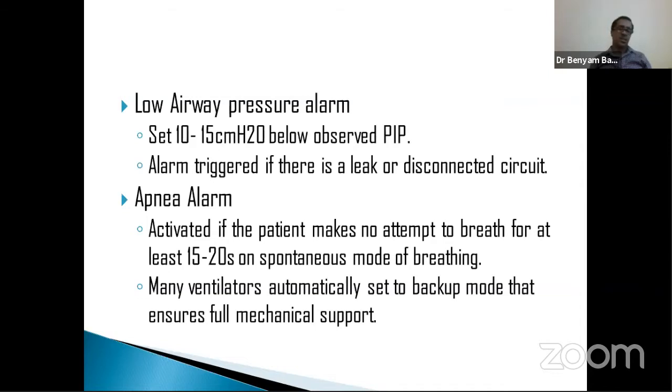And new machines that were made recently, within the last two decades, will automatically go on the backup mode and they will ensure full mechanical support. So that is for apnea alarm.